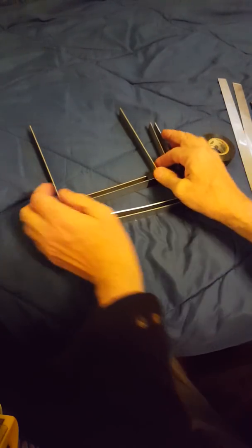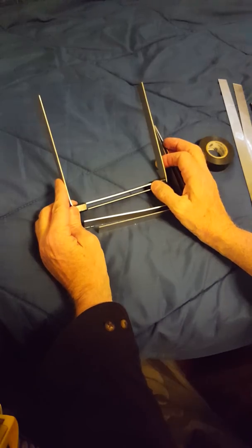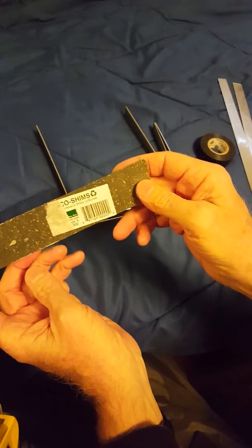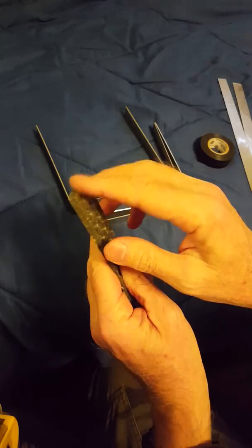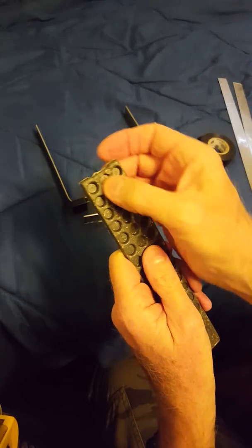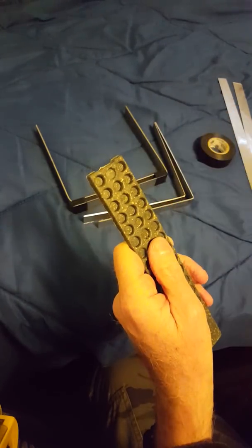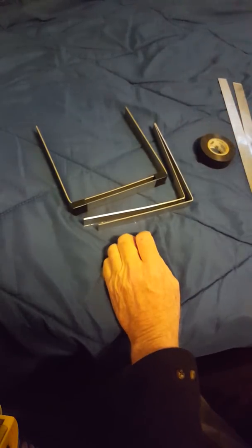Now, the spacing that you're going to want to use on these is 1/4 inch. You can use anything for a spacer, but I found the most convenient thing is these composite shims from Home Depot, because this end just happens to be 1/4 inch. So I just cut these. You can see this one, I just cut the end off and use that for my shims. They're very, very convenient. But let me show you how to make these.